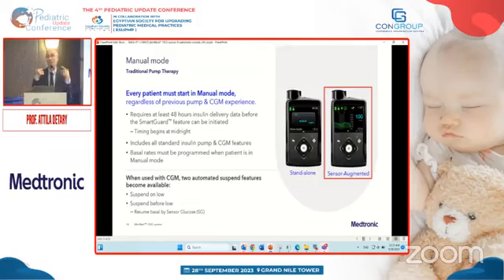That was the thinking when we were talking about traditional insulin pump therapy. Now the results with the automized system show that the shorter, the 2 to 3 hours, is better for all age groups. So for the pump, for the automized pump, it is better to set to 2 to 3 hours.